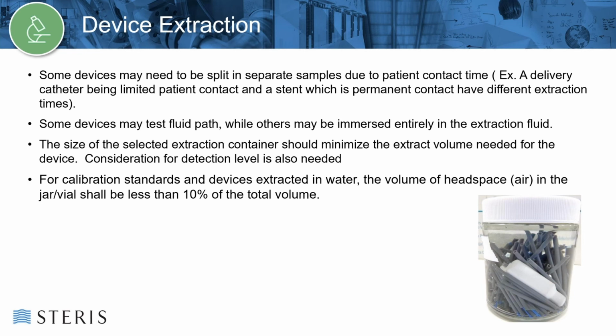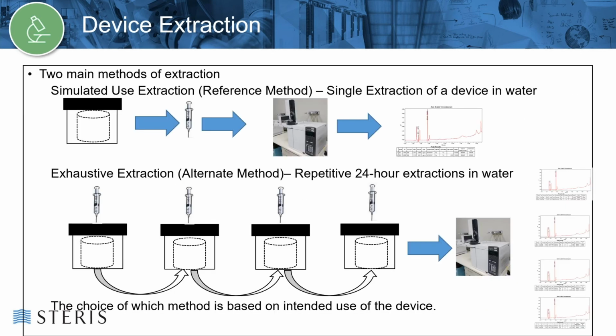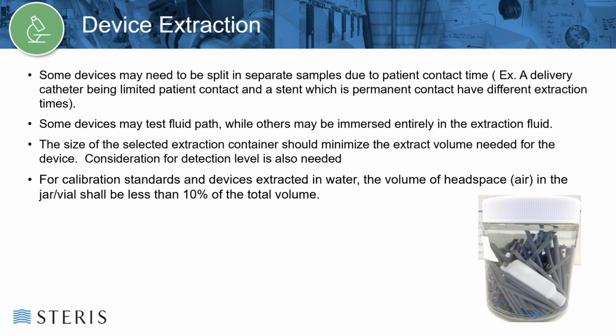Extractions continue until there is a 90% or 1 log reduction in the amount of the analyte from the first extraction to the last. The determination of whether a simulated use or exhaustive method of extraction is used is based on the intended use of the device.